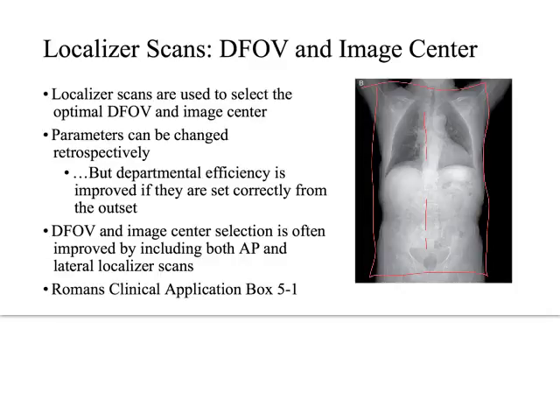It's important, one of the reasons we get both an AP and a lateral image is if you can imagine, if I draw this box on there too tight, right, I might have clipped something in that lateral view. So the tech will toggle between this AP scout image and a lateral scout image, to make sure that they've got everything that they need in both directions.